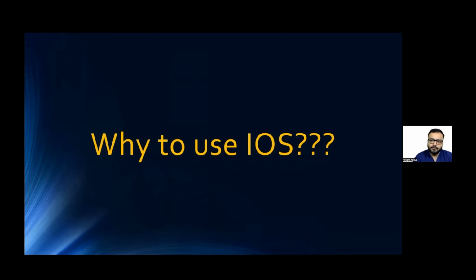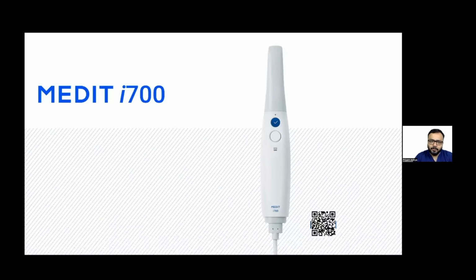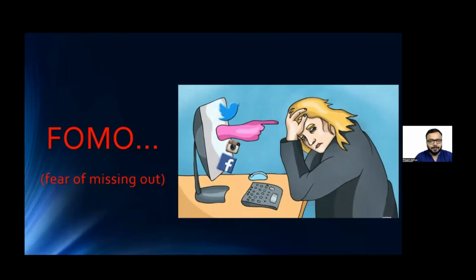I get a lot of calls from doctors asking, should we buy an intraoral scanner? Should we not buy an intraoral scanner? And unfortunately, in most cases, the reason they are buying an intraoral scanner is FOMO. They are thinking that probably the one who's next to me is buying, so I should also buy it.